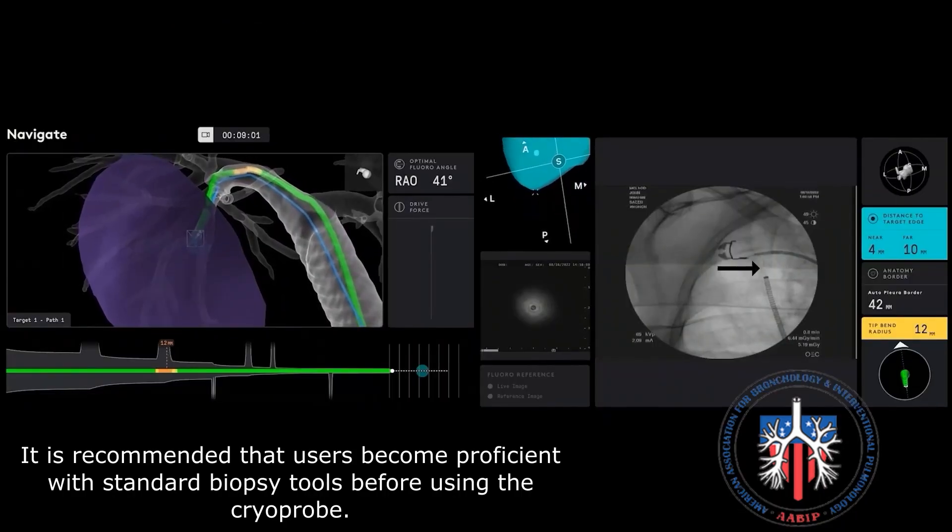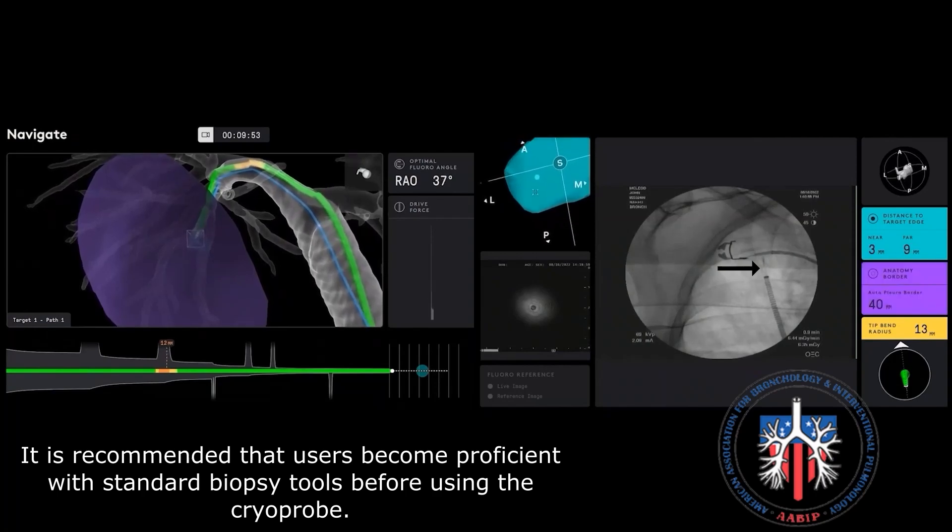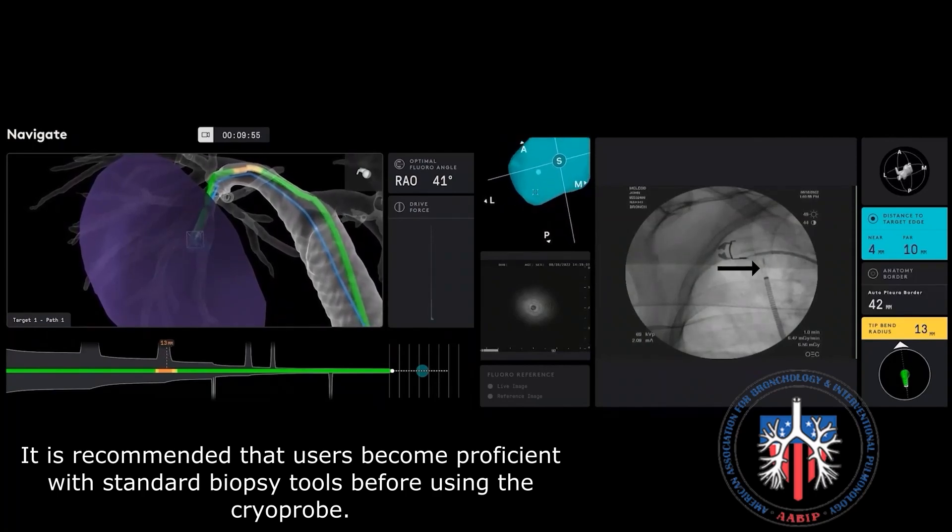In this example, we are using a 1.1 mm cryoprobe for biopsies of the right upper lobe pulmonary nodule.